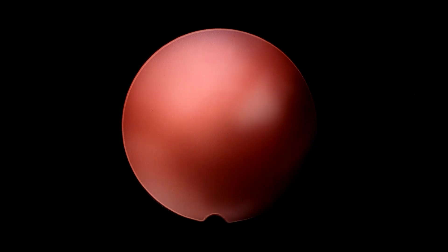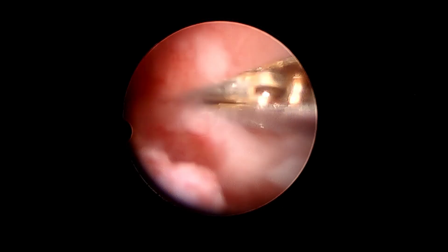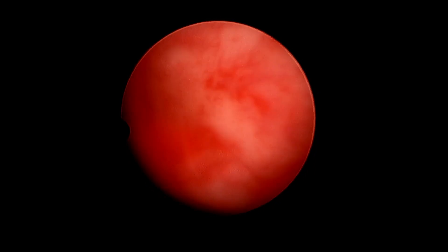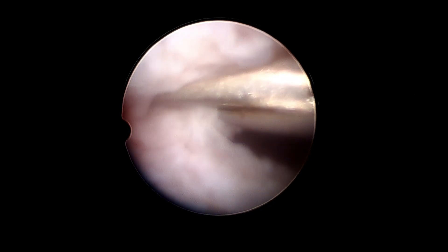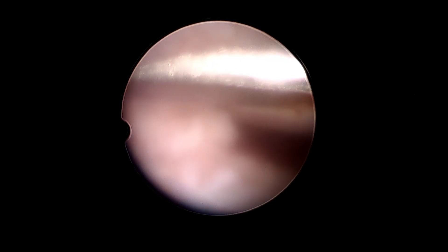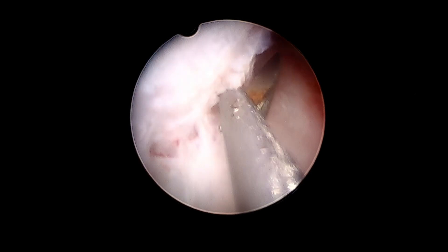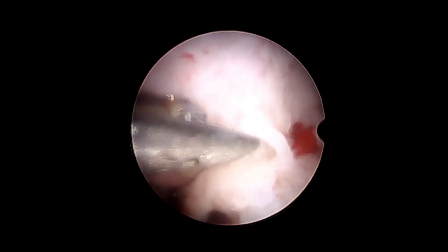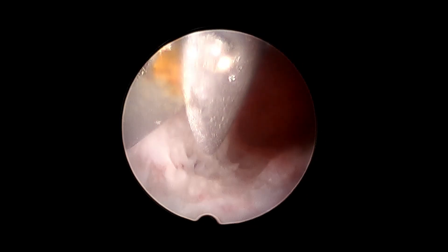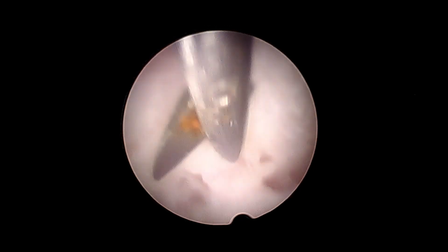Slowly cut into the center, then mark the ostia on both sides up to the extent you have to cut the septum, and then progress. The technique I follow is to give a small incision in the middle, extended up to the ostia, for as far as you can do the septoplasty, avoiding injury to the muscular rim around the ostium. Then keep cutting in the center so that you stay in the same line and avoid injury to the ostial ring.